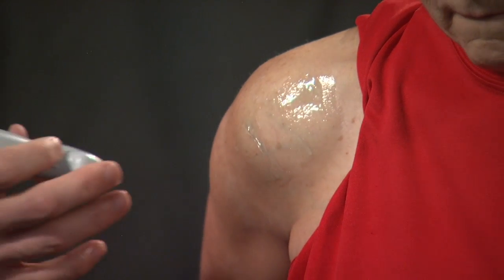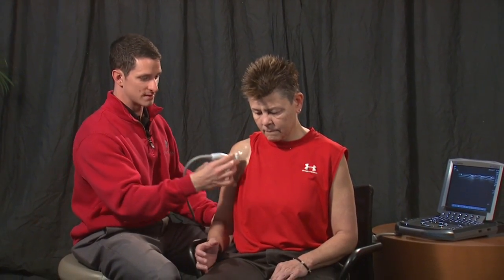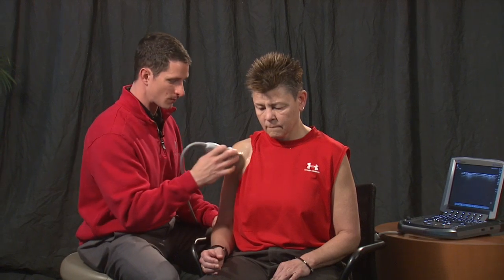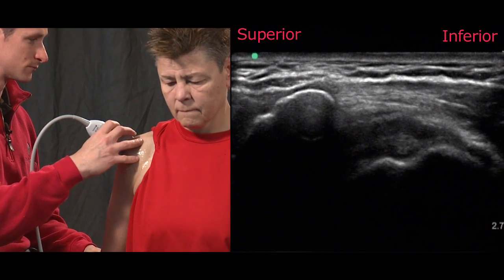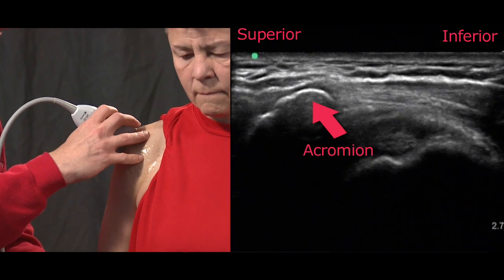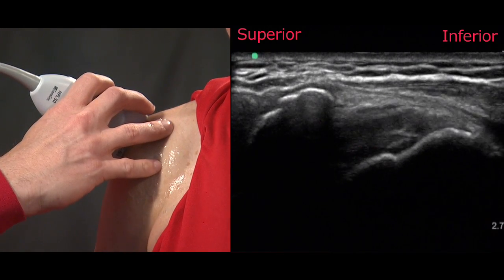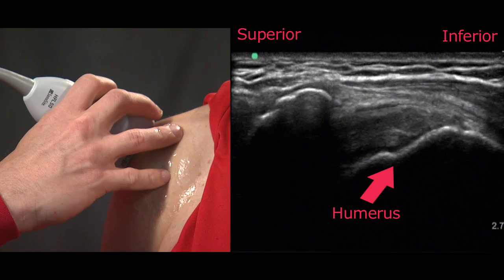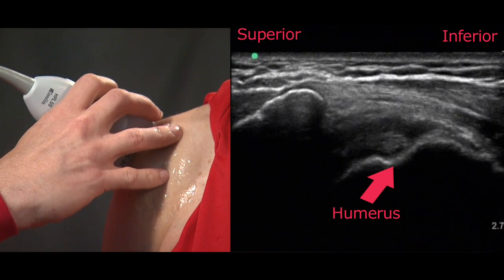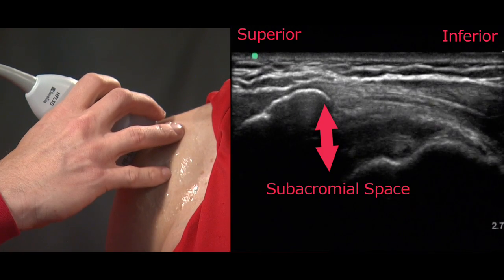Once we've completed our exam of the supraspinatus, we'll do a quick estimate of the acromial humeral distance by asking the patient to assume a resting position while we palpate for the lateral anterior border of the acromion and place the superior margin of the transducer just anterior to that region. On the screen you can see on the left side the acromion with a characteristic acoustic shadow behind it, and just deep to it on the right side you can see the superior margin of the humeral head. This image is significant as it signifies the rotator outlet, which is often decreased in severe rotator cuff disease.